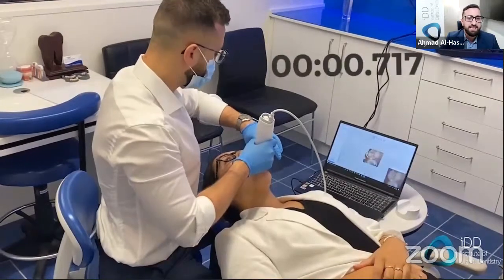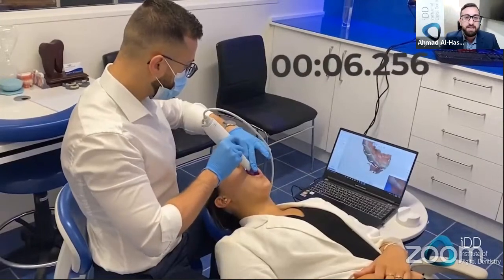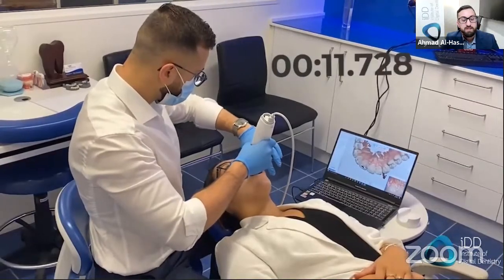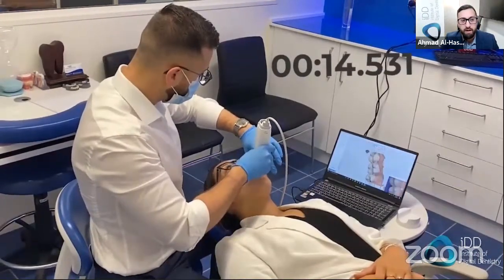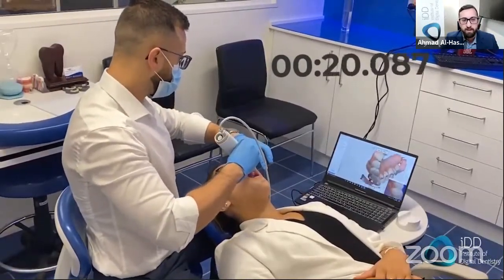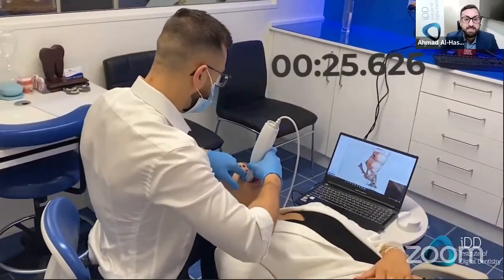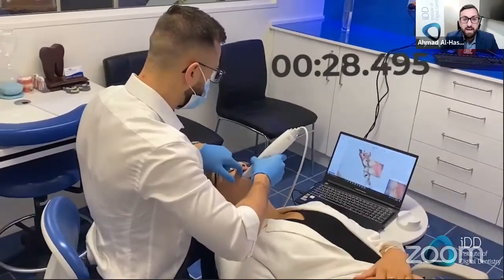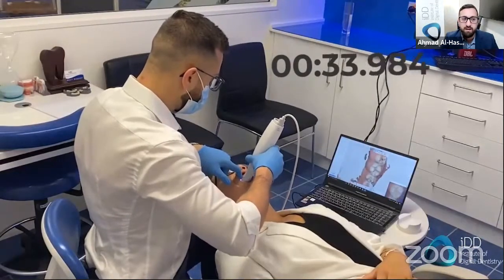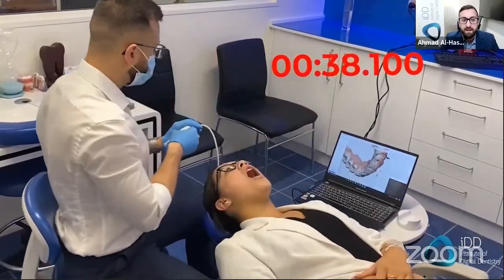Now, when you compare that to what we can achieve with scanners these days, this is a simple example of me taking a scan with a Medit i700. It's just no comparison anymore. The speed of these things is much better. The comfort to the patient is a whole lot better. And generally, it's just a lot easier. I can teach a dentist very easily within a week or two how to scan proficiently, and that's a testament to how advanced the technology is now. As you can see in this example, you can achieve full arch scans easily within about a minute.